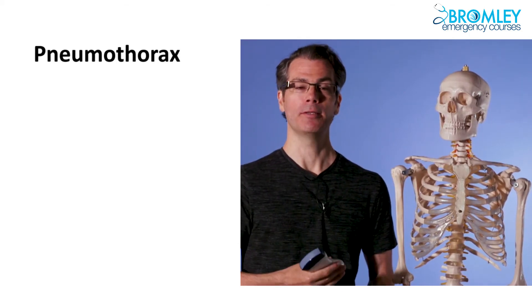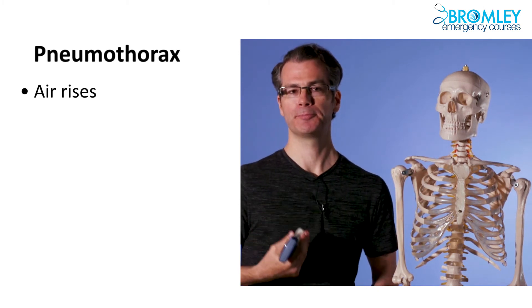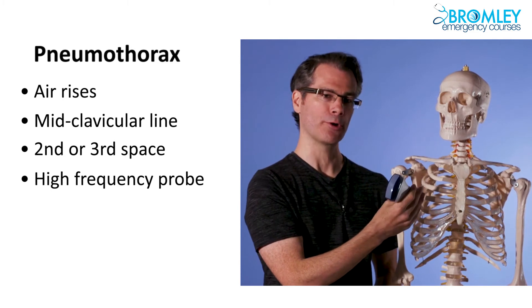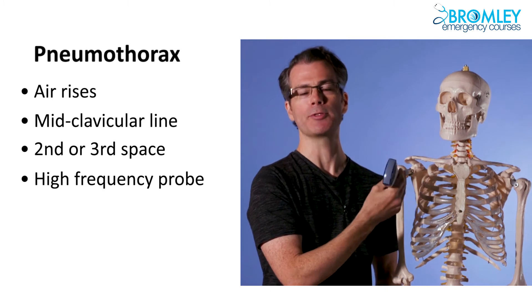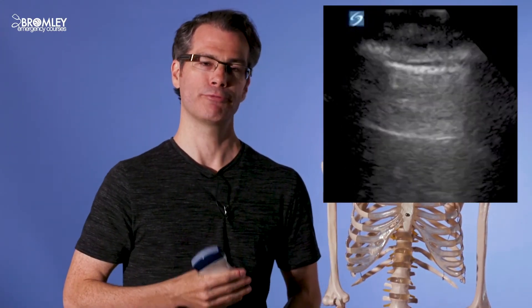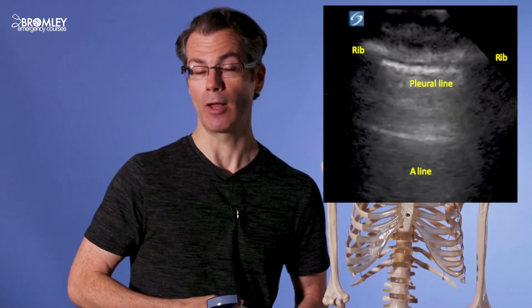The fifth and final component of the E-FAST exam is the assessment for pneumothorax — the anterior chest. Air rises to the highest point in the body, so in a supine patient we look at the anterior chest. Place the probe in the mid-clavicular line in the second or third intercostal space. You can use the low-frequency probe, but it's actually better to switch to the high-frequency probe for better resolution of the pleural line and to see pleural sliding better. Have the probe marker to the patient's head. You'll see ribs on either side of the image, the pleural line just deep to this, and another horizontal line deep to the pleural line called an A-line. An A-line is normal — it's just an artifact: the ultrasound beam bounces off the pleural line, goes back to the probe, then goes down again, bounces off the pleural line again, and the machine thinks it must be twice as deep, so it plots another line at the same distance again. This is just a normal artifact.